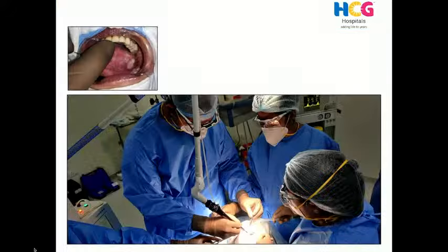In flight in various regions in head and neck. And specifically, I am going to talk about application on head and neck surgery. Of course, laser ablation, you tend to use it in multiple areas. But basic thing is, whenever you use any new tool, it should not harm or it should not compromise any outcomes. So in head and neck surgery, it can be used with the handheld attachment to perform oral cavity surgeries.